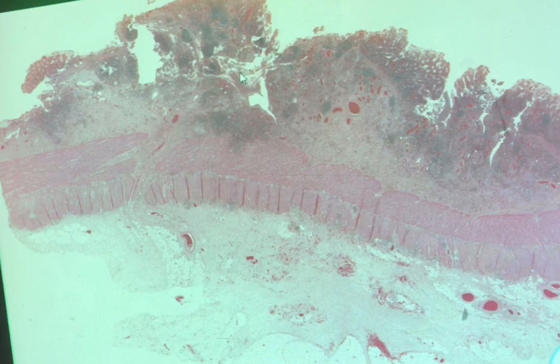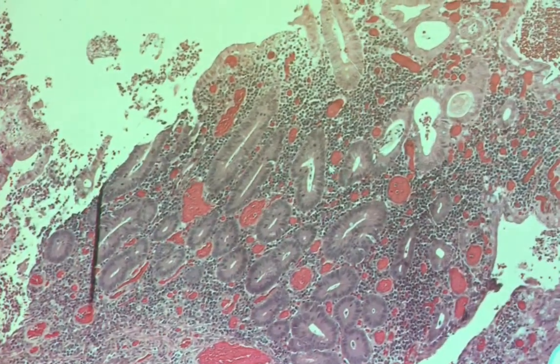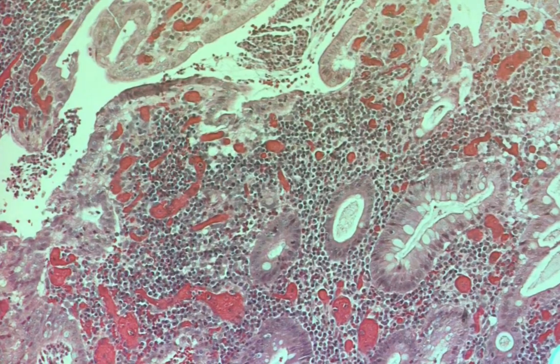Okay, first thing we see is that maybe this stuff looks more like normal bowel. But all this stuff, this looks like maybe it's ulcerated. We have inflammatory, or what looks inflammatory because it's so blue, going down into the muscularis propria. And okay, so let's just start over here. And what we see is that generally, yes, this is massively inflamed.